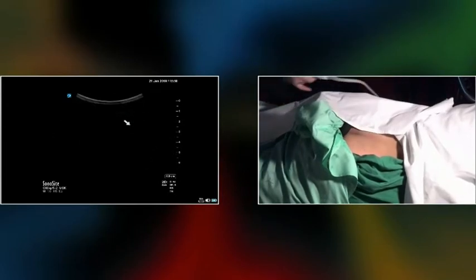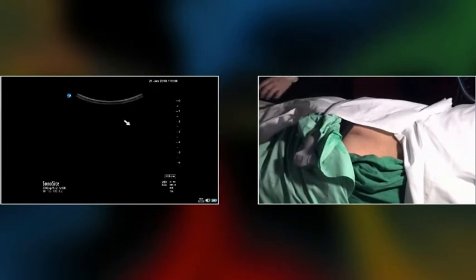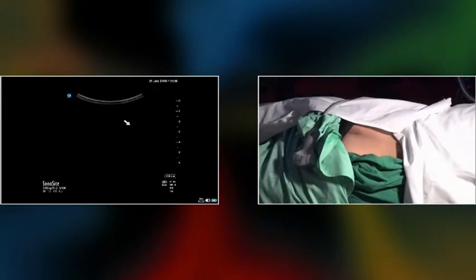Yeah. Great. Thank you, because a lot of the time with fluoroscopy, sometimes it's quite difficult for me to identify the lateral sacral crest, and this is very useful.